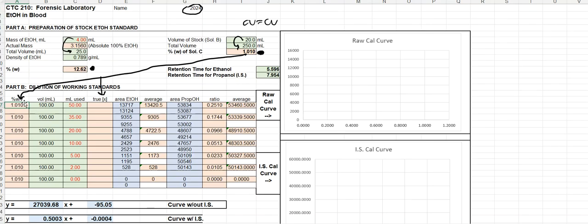All right, well, in the standard prep, we took 50 milliliters of that standard concentration and we diluted it to a total of 100 mils. At least that's what the batch of 2024 did. Did we dilute to 100 mils? You got to go back and watch the videos to find out. You got to key that in if you didn't.